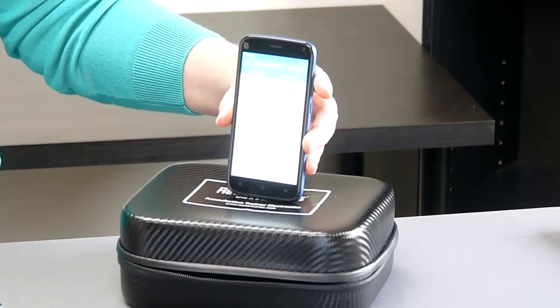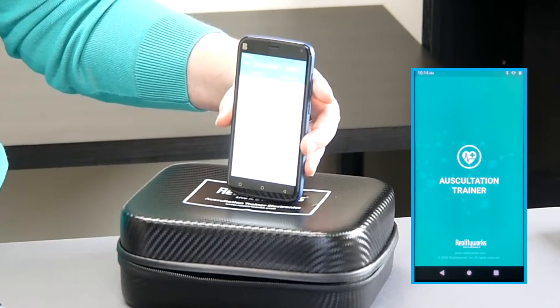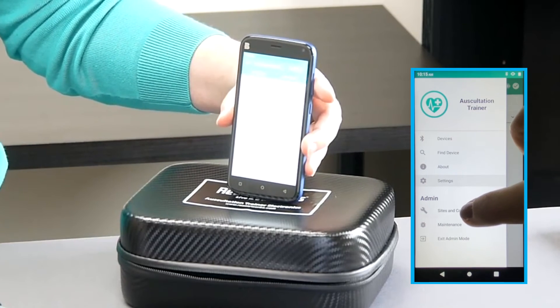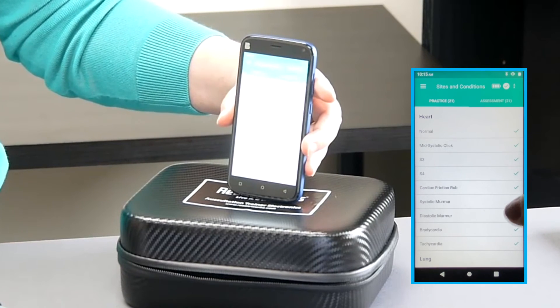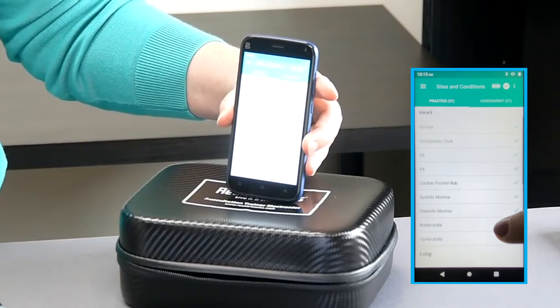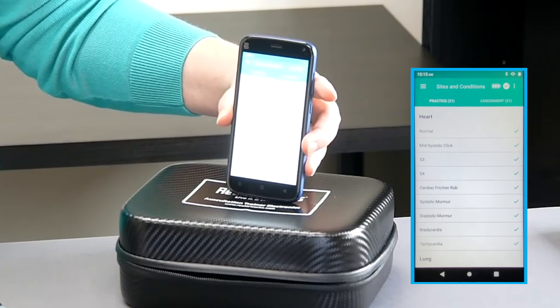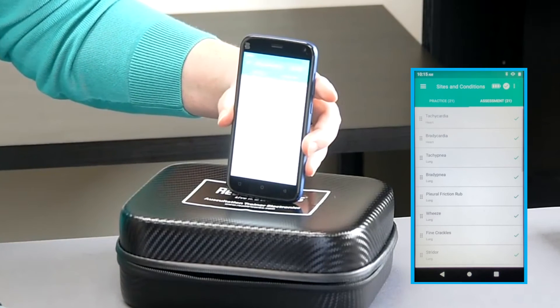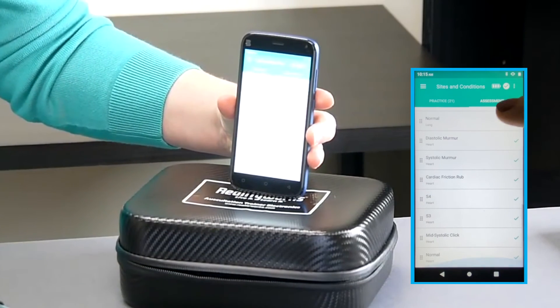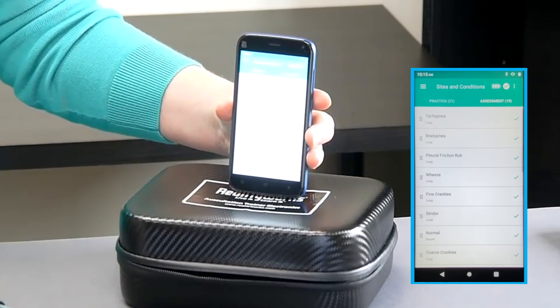So how do instructors control which sounds students are practicing or being assessed on? By using the admin menu. When you first turn the tablet on, tap the RealityWorks logo and you'll be taken to the admin menu — your screen will turn from red to blue. Use the three-lined icon at the top to access the menu elements. 'Sites and Conditions' allows you, as the instructor, to choose which of the 21 conditions you would like students to both practice and be assessed on. For example, if you're focusing only on lung sounds, you can select those and unselect heart and bowel sounds. You can add on additional sounds as your students progress until they are ready to assess all three body systems. To remove particular sounds from your list, simply press the checkbox and it will be removed from the available sounds.